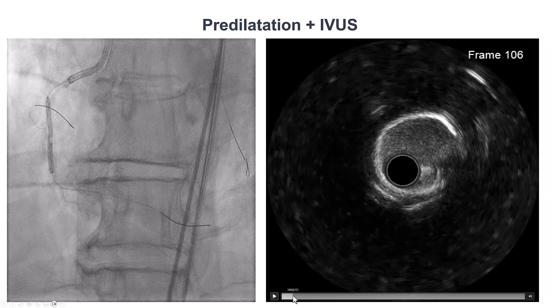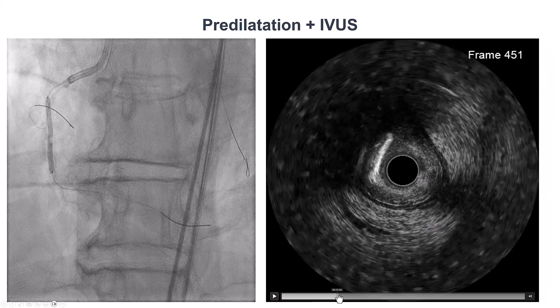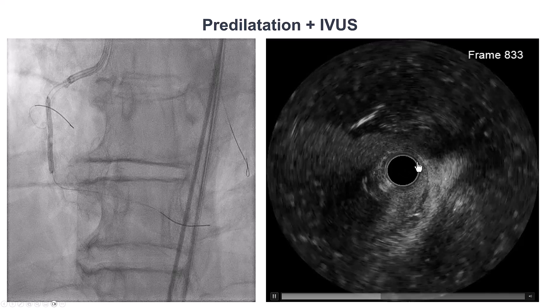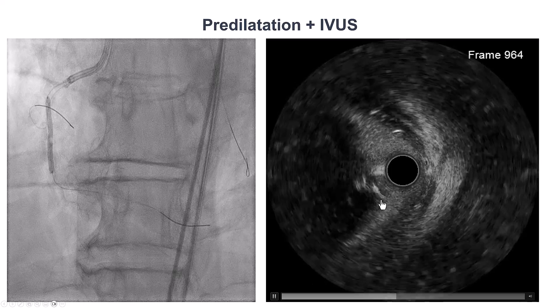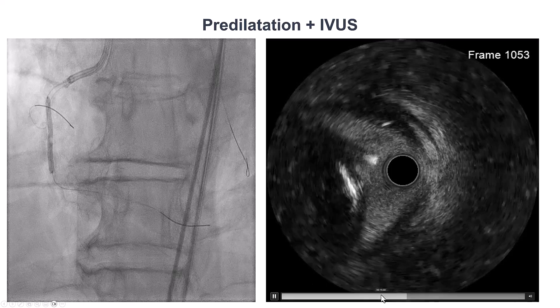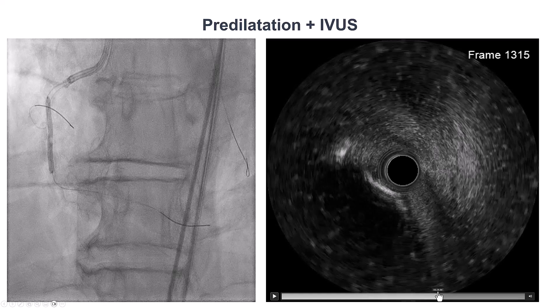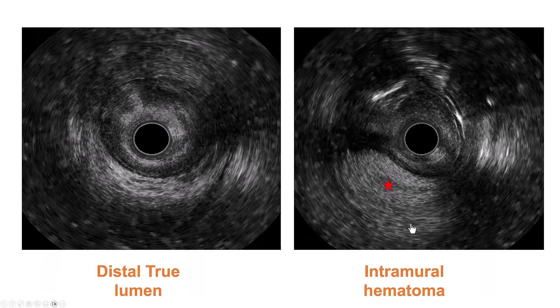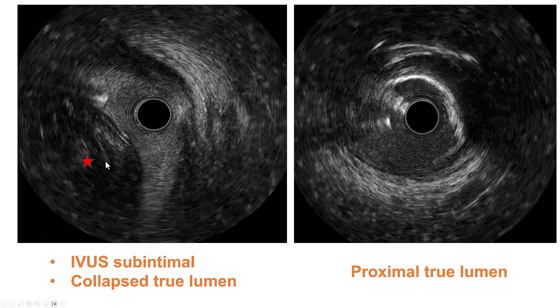The intravascular ultrasound is quite interesting: we have some subintimal entry of the vessel, some calcium, and an extraplaque position — we can see we are outside the vessel architecture with an oval shape. The still frames distally show the true lumen. There is an intramural hematoma, likely from use of the knuckle wire. The true lumen is collapsed distally, but proximally we are, as expected, in the true lumen.